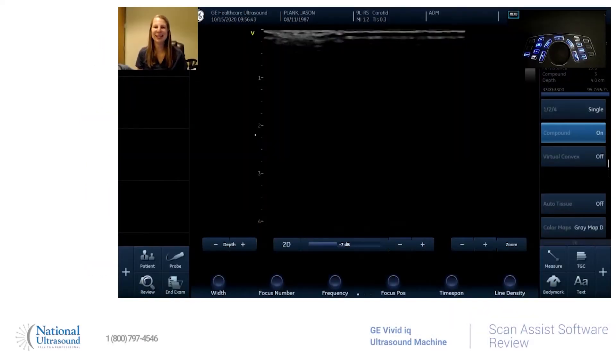Hi, my name is Jackie Klebeck. I've been a registered vascular, cardiac, and general sonographer for eight years. I am at National Ultrasound here on a GE Vivid IQ, and today I'm going to show you the basics of the ScanAssist option.